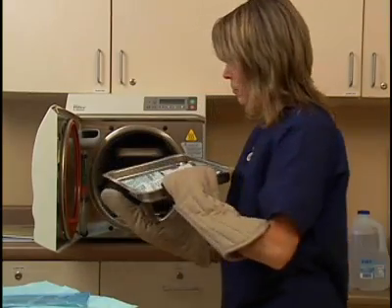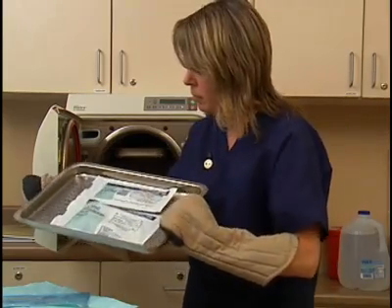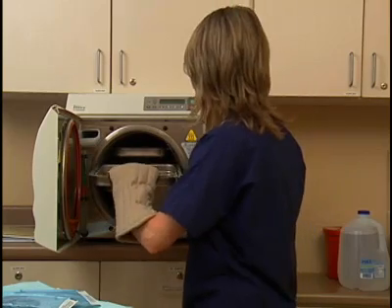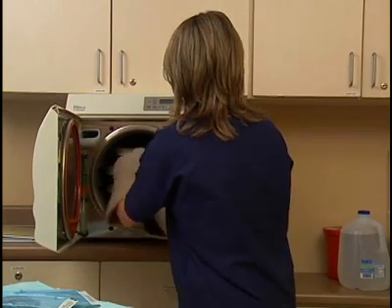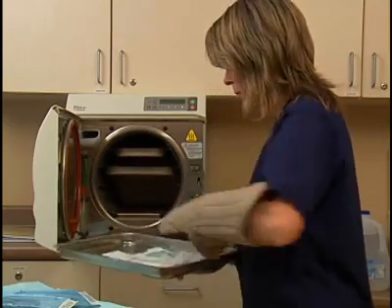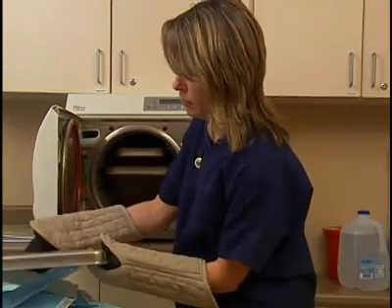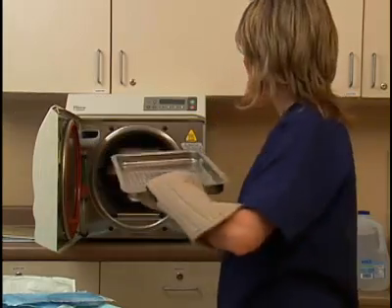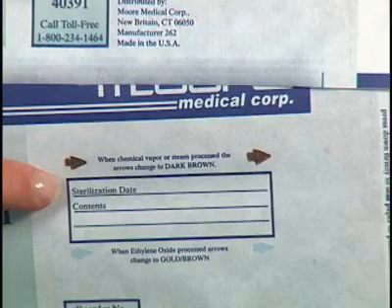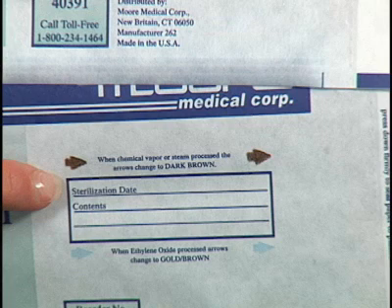Wear heat-resistant gloves to remove the load to avoid burning your hands from the hot packs. Do not touch the inner chamber of the autoclave as it is very hot as well. Inspect the packs as you take them out of the autoclave. If the packs show any damage, such as holes or tears, the articles should be rewrapped and re-sterilized. Check the sterilization indicators located on the outside of the pack to make sure the proper response has taken place.